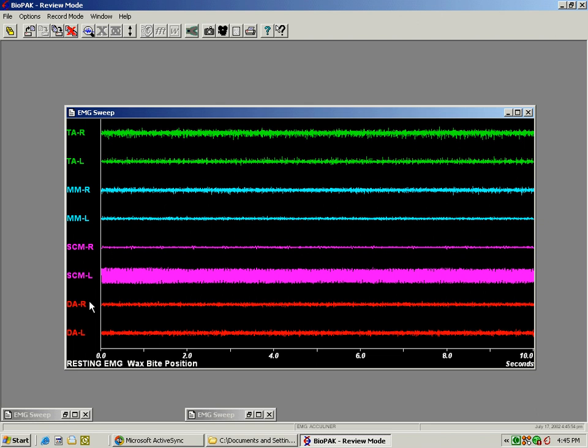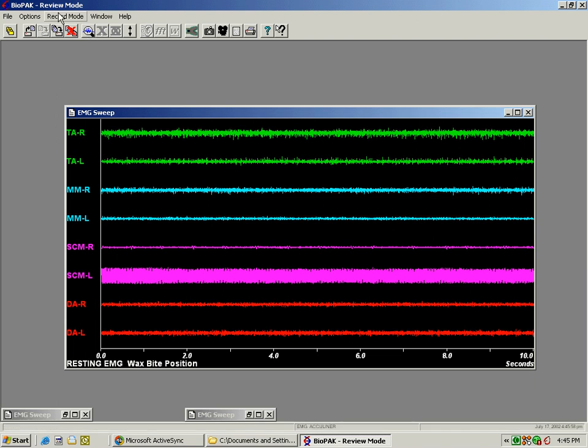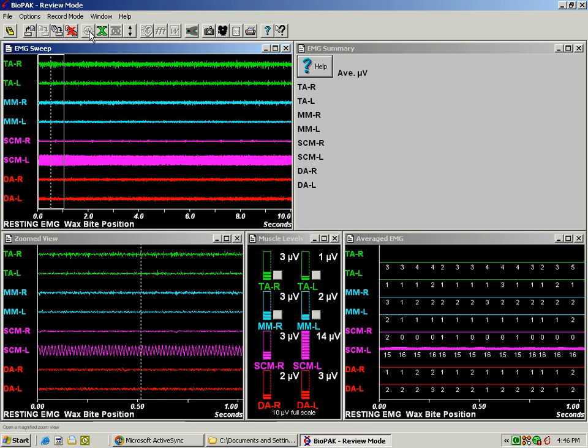Now the first thing that we do to review electromyographic data in the review mode is to click on the zoom button, and that gives us our windows that we will use to interpret electromyographic recordings for whether it's rest or clench, swallow, etc.